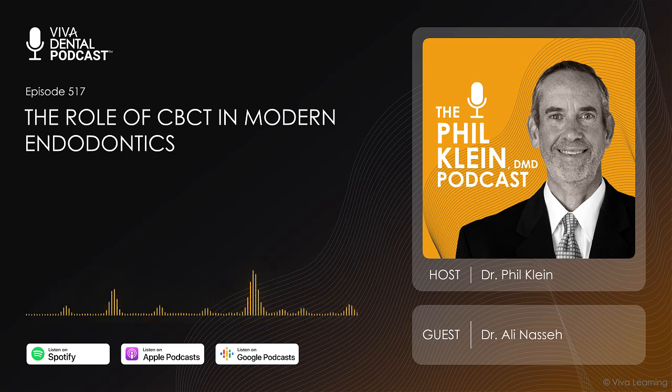And it really wasn't until regular radiographs moved on to panoramic, and then CT imaging came around, and then more recently, CBCT, which is more confocal and cone beam limited to a smaller area with higher resolution, became possible, along with software improvements to render these images with more resolution and to manipulate the image to get a little more contrast and detailed information, that we really got a chance to see what we're dealing with before entering the tooth. And this was information that was really pivotal and, in my opinion, game-changing.